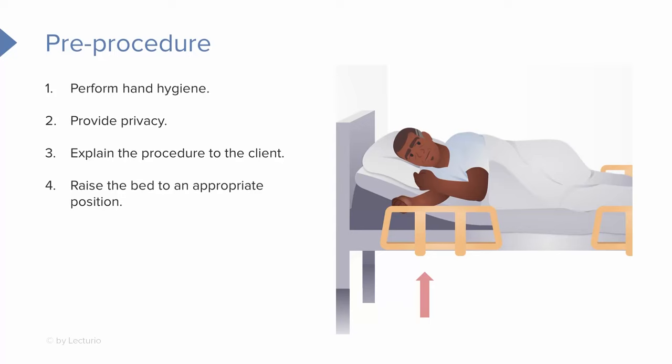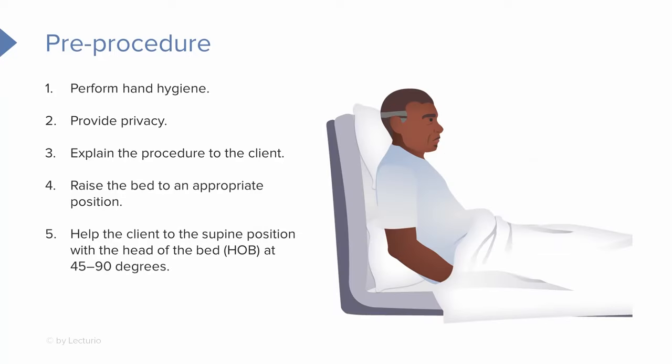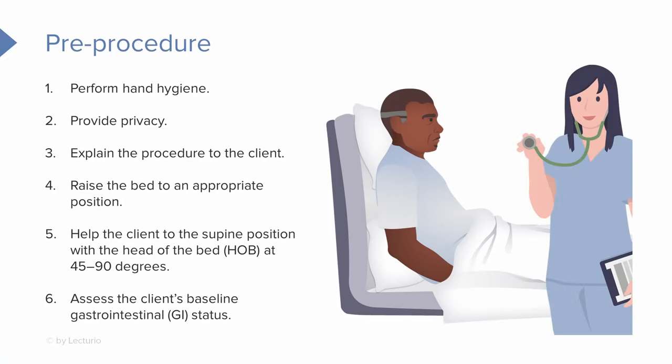We want to raise the bed to the appropriate position and help the client to an upright position — at least 45 to 90 degrees. The higher the bed, the easier the insertion is going to be. Also get a baseline idea of what the patient's GI status is and how they feel before you insert the NG tube.